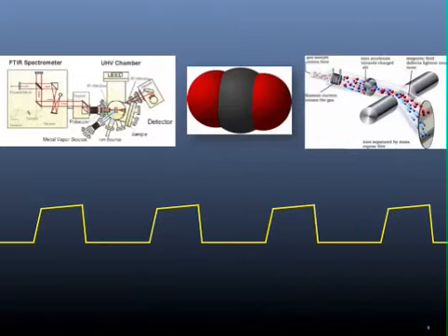Quantitative waveform capnographs, on the other hand, actually detect CO2 molecules, either with IR spec or mass spec. So it really approaches a true gold standard because you know there's CO2 getting to the machine. It takes a beat for the CO2 to get up to the machine and the waveform to register. It's just like that second after the adenosine starts working where you know the heart's going to start again, but it just seems to take forever even though you know it's only a second. But once you see that waveform go up and come back down, you know your tube is in.